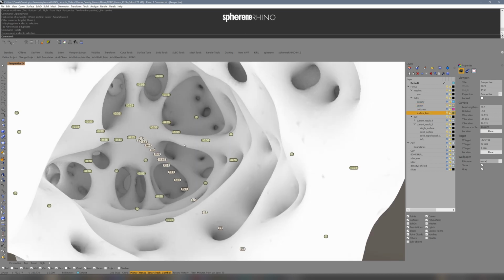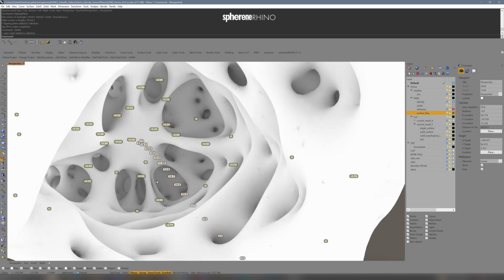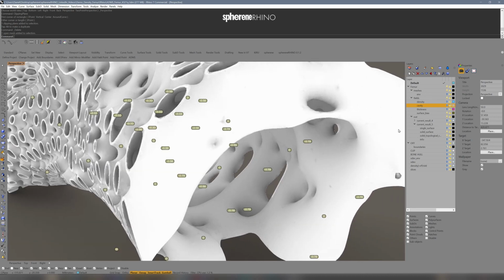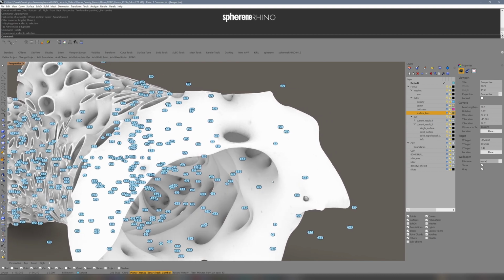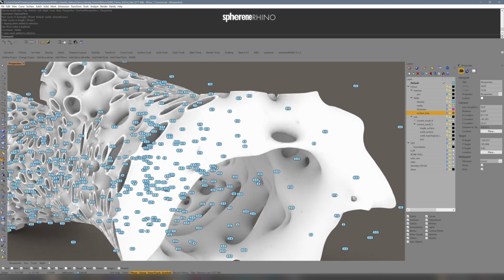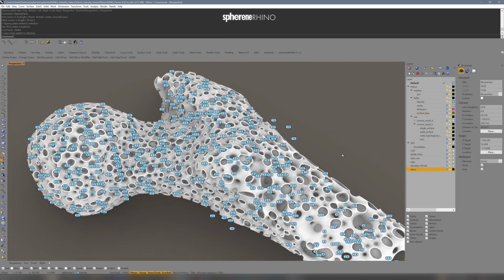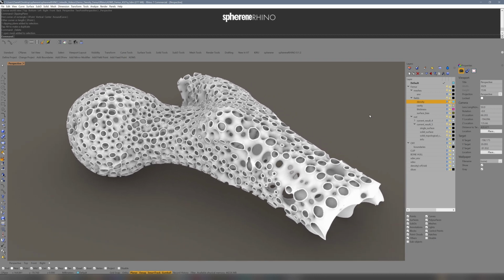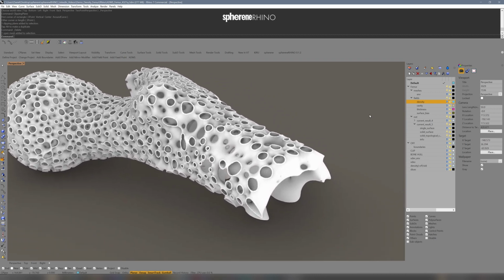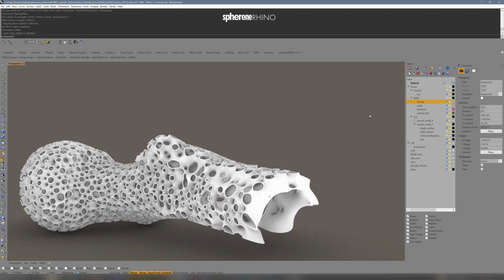What you also see is that we have this more stringy kind of ADMS structure that has been created by using the surface bias, shifting the minimal surface a little bit to the side, creating these kind of stringy structures. Then, of course, we see the different layers of density. So we have a high density on the outside and then go lower for the inside, all in three dimensions by the use of the section slices we did before. All this creates this beautiful ADMS structure with different densities, cavity points, and the surface bias.